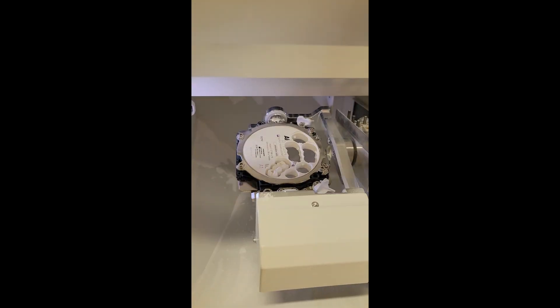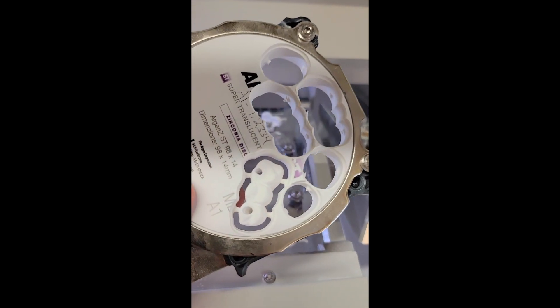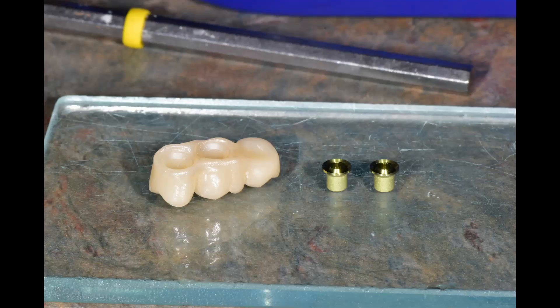Once the bridge has been designed, we mill it out in a milling machine that I actually have right here in my office. This chalky white material called zirconia then gets baked in an oven overnight where it hardens tremendously — it's very dense and it turns into a tooth-looking color.